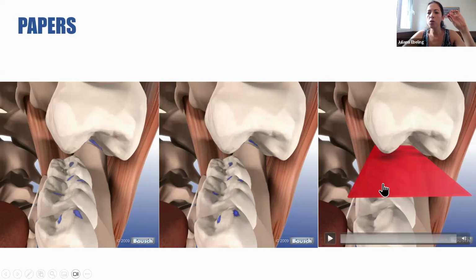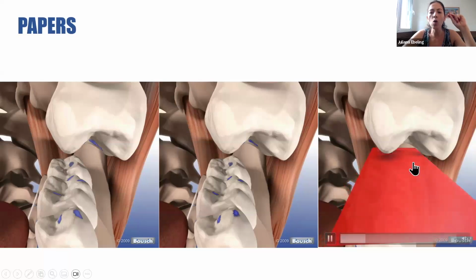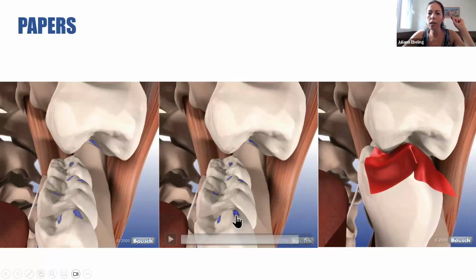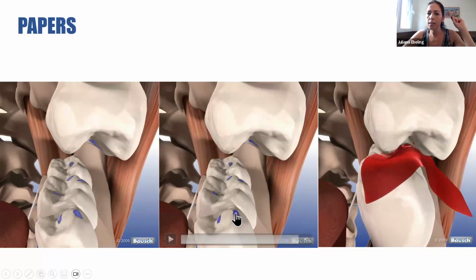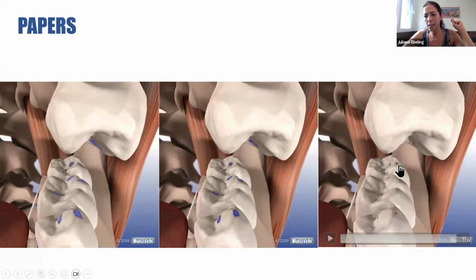So when I go to 8 micrometers, this is a sheet, it's not paper, it's aluminum. It's a sheet that has color, and there's no glue on this kind of paper. They use the glue from the other. We have very, very delicate contacts. These are the real contacts, because they represent where we have real contact. And normally, how do we use this paper?